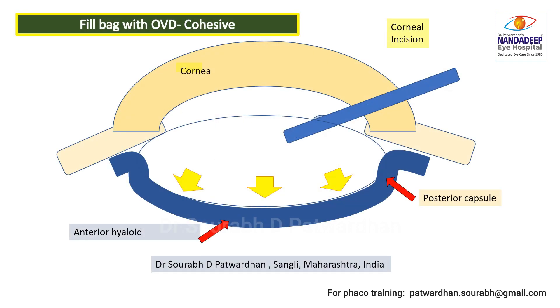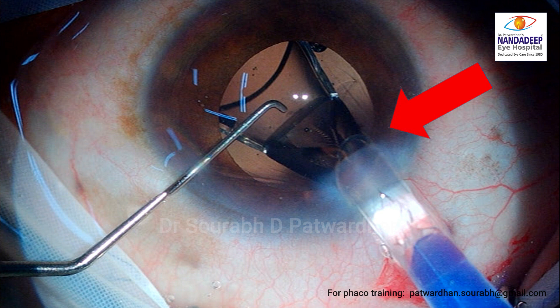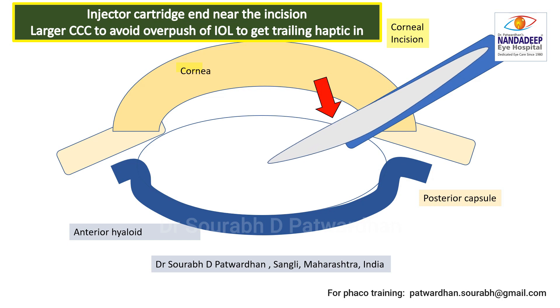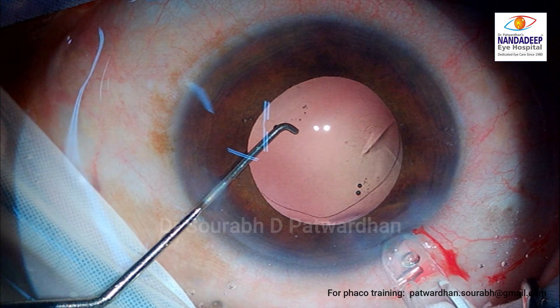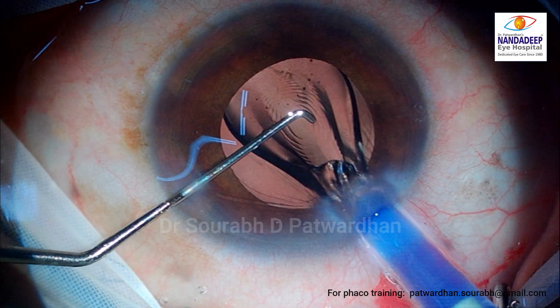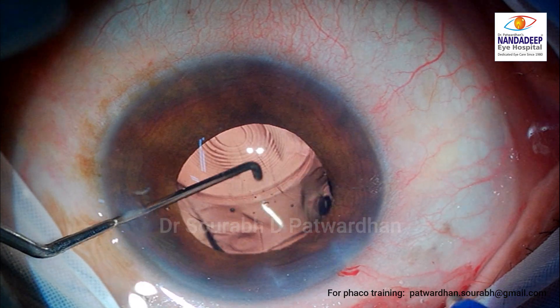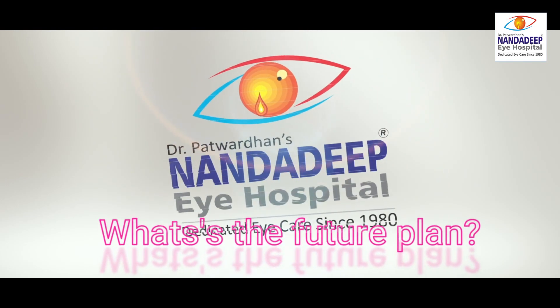So how to prevent this? One is plenty of use of OVD. Cohesive OVD can also be used so that the posterior capsule is pushed back. Then the injector cartridge end is kept near the incision — the injector cartridge should be near the incision, giving space for the IOL to unfold and not drag the capsule with it. Also, a larger CCC will be useful to avoid over-pushing the IOL to get the trailing haptic in. This is the method to inject the plate haptic IOL: the cartridge is at the incision and then the trailing haptic is pushed down in the bag. This should prevent this particular complication.